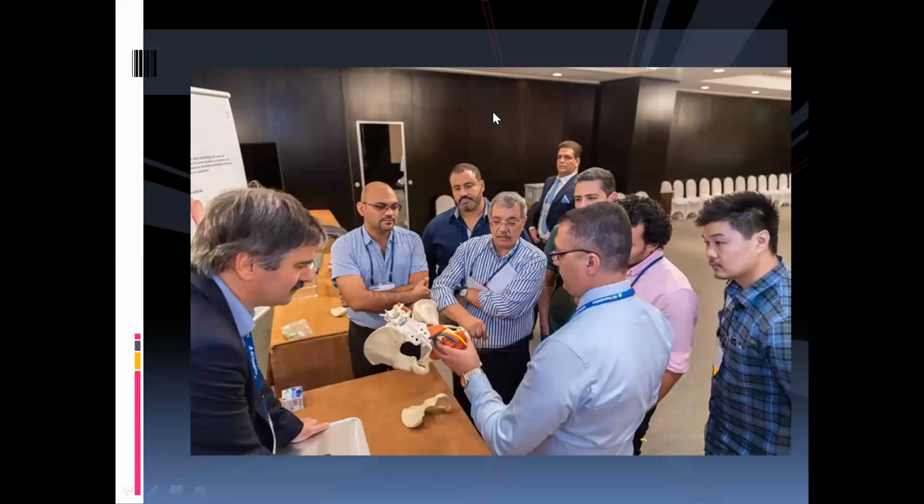Dr. Mukhaled Walid, welcome. Is grafting a must in protrusio? Yes, because if you don't have it, you will again have an oval shape acetabulum. It is very difficult to have the acetabular shell or cup implant incorporated, as there will be only about 50% attachment with the bone.